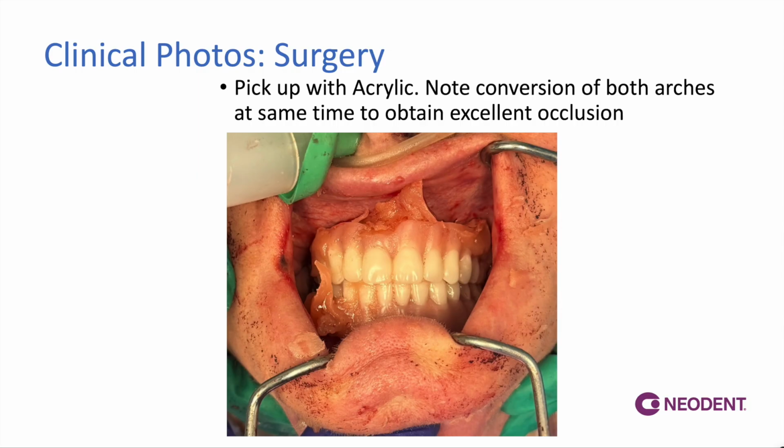After we are very happy with the look of our Neoconvert copings, and after we have verified that our conversion prosthesis fits and doesn't move around, isn't loose, and that we have a proper occlusal plane, proper midline position, and also proper occlusion, then we can hook up our prosthesis. The way that we hook up our prosthesis is with acrylic.